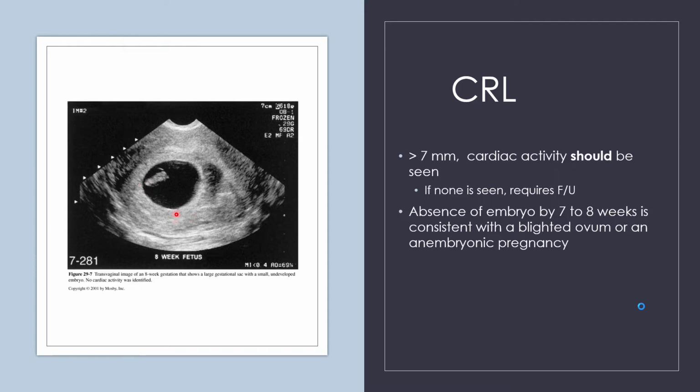Well, this is an 8-week fetus that they've measured, and there's no cardiac activity identified. So this is a fetal demise. So that's what's happened: the baby passed away, but the sac continued to grow. Okay, so that's why it's a little disproportionate.